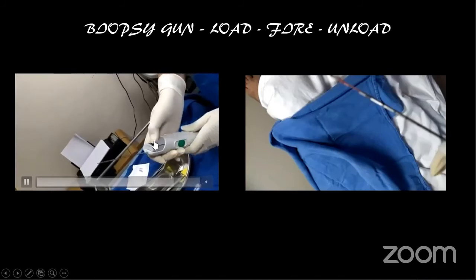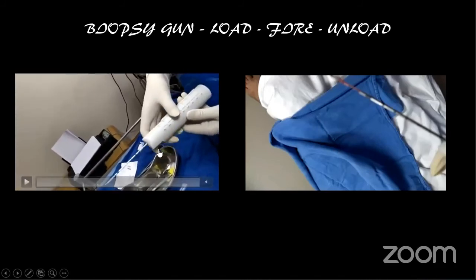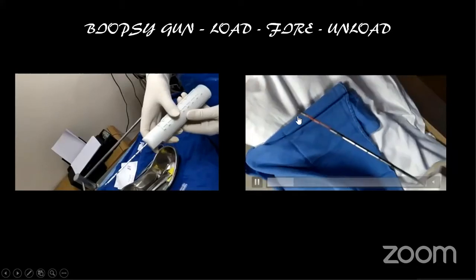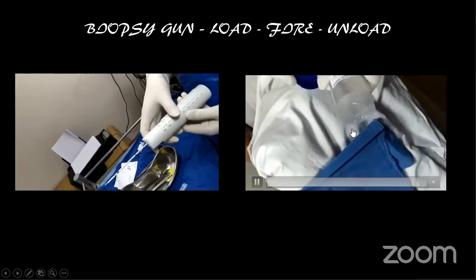And then to expose the sample notch, we press a single button only. So loading by pressing 2 buttons, and sample notch exposure by 1 button only. So now see, this is the sample notch where the tissue is here, and we put it in the formalin bottle.